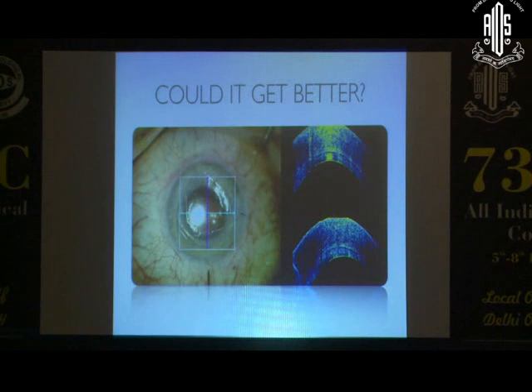One of the advantages of having an instrument like an OCT during surgery is the fact that you can actually see for sure in the different areas of your DSEK lenticule and see how well it is attached, because manually there's no way of doing that even with a slit lamp.